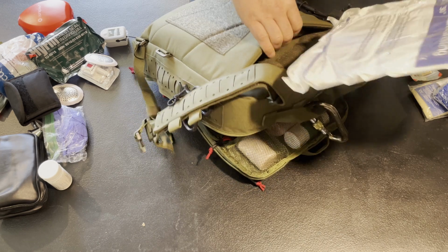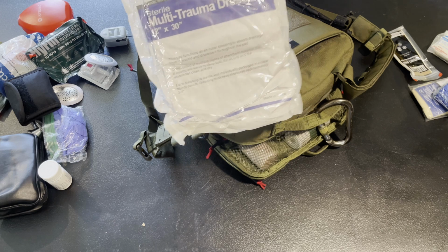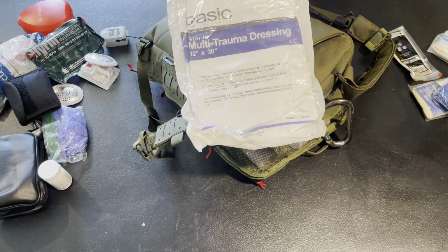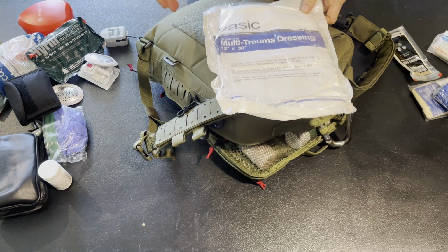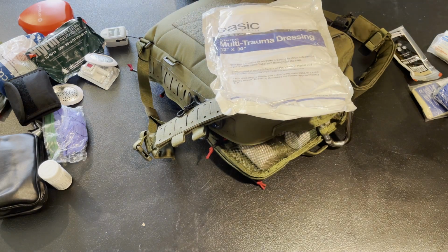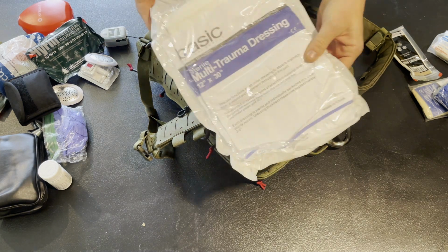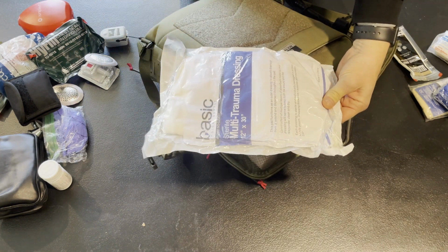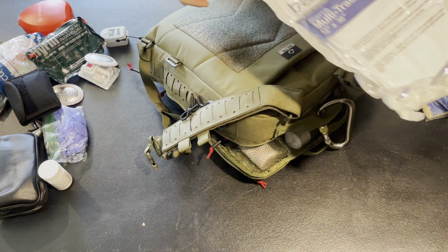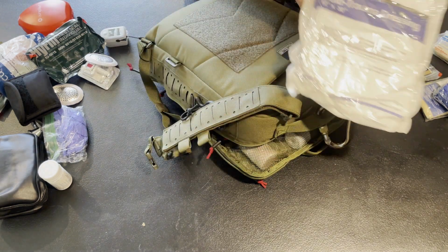And in here I carry a super big trauma dressing for big bleeding, but mostly for abdominal wounds. With abdominal wounds, again, I'm not teaching how to be an EMT here, you don't want to pack like you would for penetrating wounds in your extremities or your junctions. You don't want to put anything in the abdomen. So if you had an abdominal injury, you would just place this over the top of the abdomen and then secure with tape or ACE wraps or whatever. Or if there's just a ton of bleeding, big abdominal trauma pad.